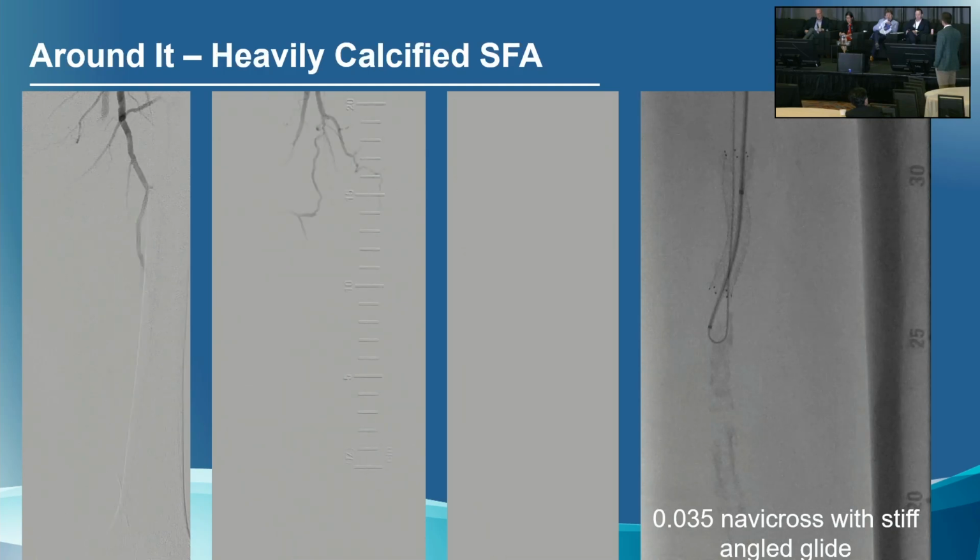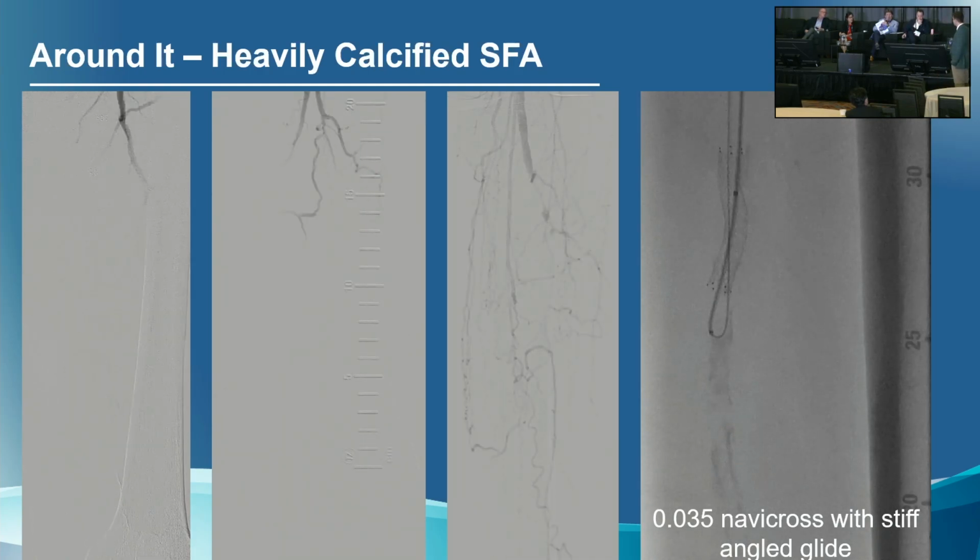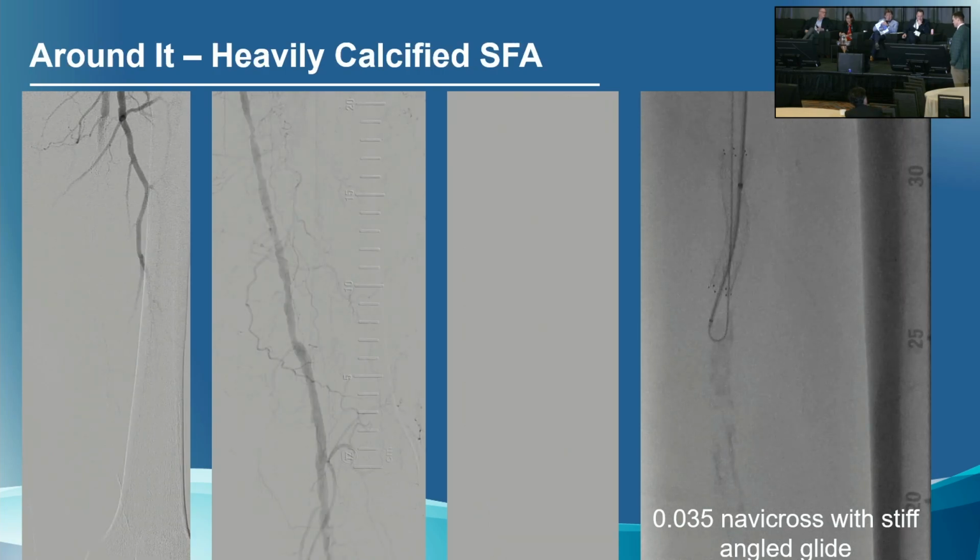And one other crazy question. Did you ever get a look at the angiogram after somebody put that stent in? Because if somebody put a stent into a subintimal plane, it could be there.